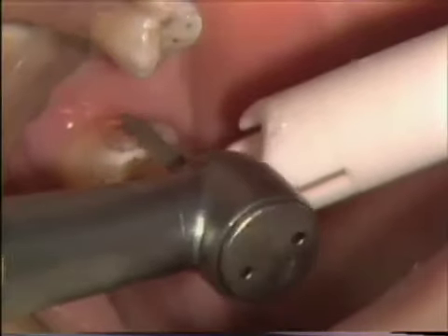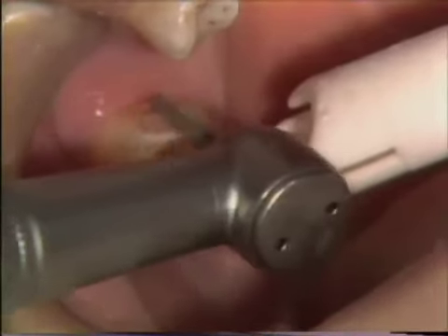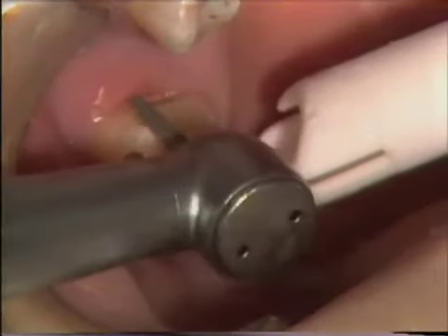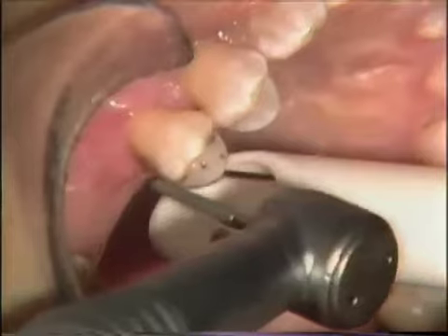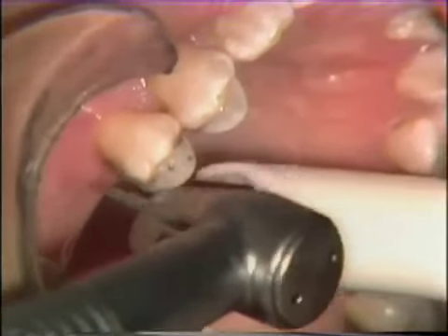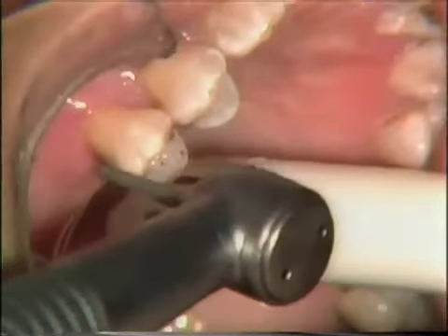Okay, here we go — slight discing. You want to make sure that you stay in enamel for this, so we just flatten that and go onto the lingual surface slightly and round that. The pencil marks are important so you can see the extent of your finish line. We're going to prepare the slice on the distal of the bicuspid. Light touch, and just a little bit of a wrap around on that mesial-distal buccal. It's important that you wrap around to get a grasp.